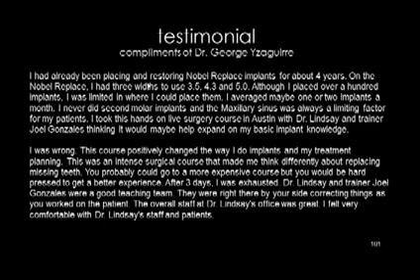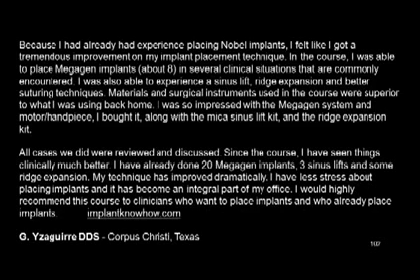The overall staff at Dr. Lindsay's office was great. I felt very comfortable with Dr. Lindsay's staff and patients. Because I had already had experience placing Nobel implants, I felt like I got a tremendous improvement on my implant placement technique. In the course, I was able to place Megagen implants, about 8 in total, in several clinical situations that are commonly encountered. I was also able to experience a sinus lift, ridge expansion, and better suturing techniques. Materials and surgical instruments used in the course were superior to what I was using back home.